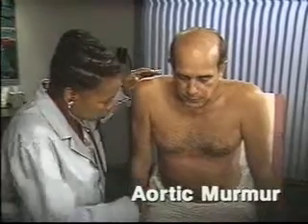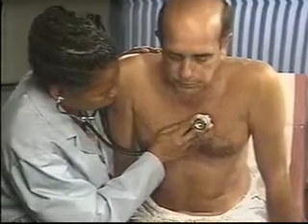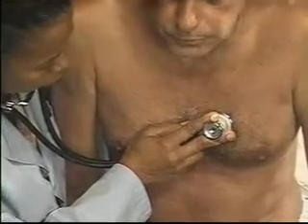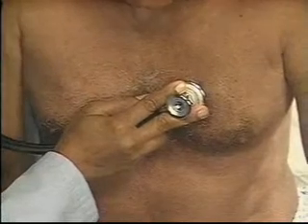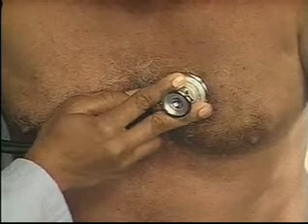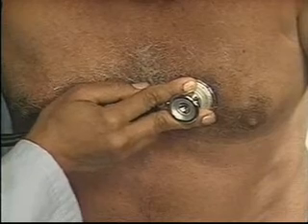To help detect aortic murmurs, especially that of aortic regurgitation, have the patient sit up and lean forward. Then ask him to exhale completely and hold his breath out. Using the diaphragm of the stethoscope, listen at the left second interspace and down the left sternal border to the apex. Breathe out completely again and hold it. Pause periodically to allow the patient to breathe.